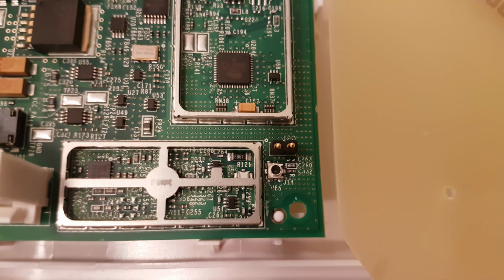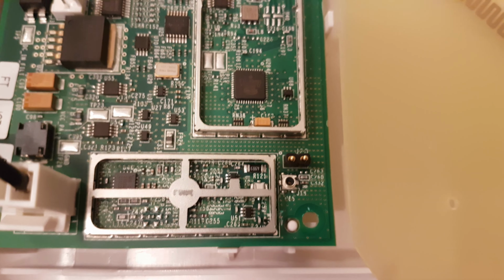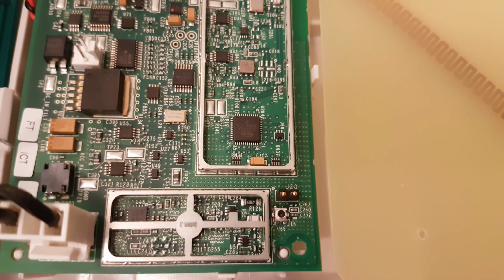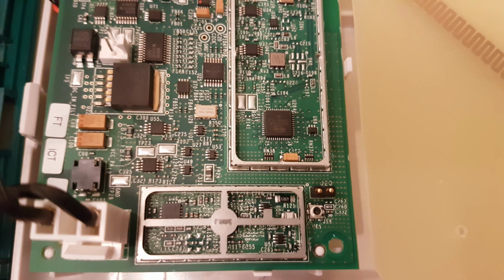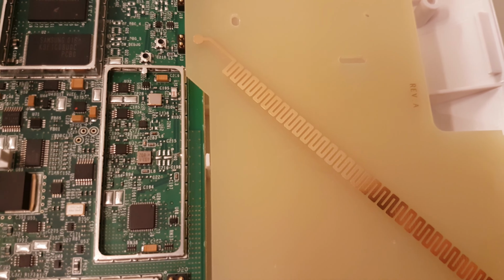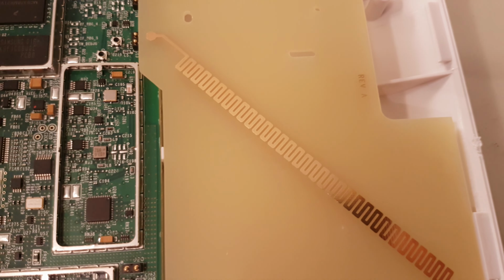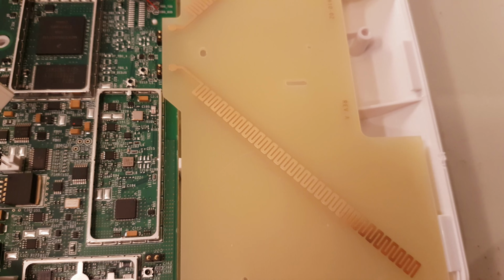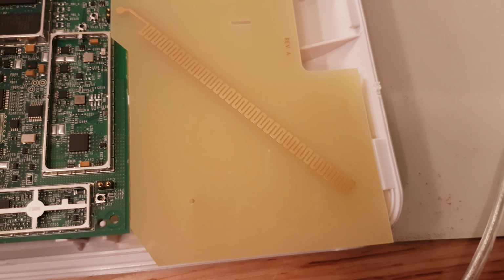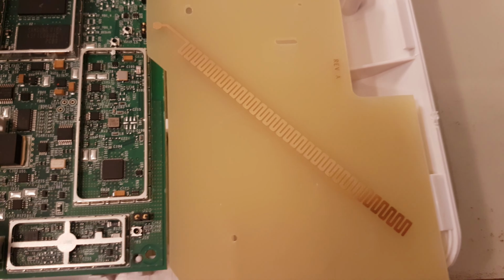And what it does, it can be operated, I guess, on a lower power. So the 2.4 gigahertz radio, I guess it has a 60 to 90 second or something like that timer. And it's kind of like a ping that can be used to wake up the big boy, the 400 megahertz antenna. And that's the antenna that's used to transmit statistics about the pacemaker and how it's doing. So that's the communication. That's how it communicates back and forth with the pacemaker. So that explains those two radios.